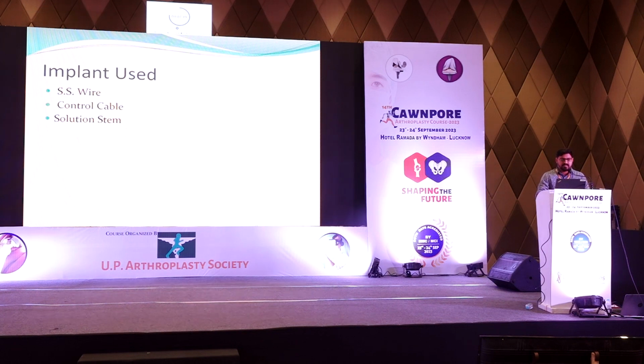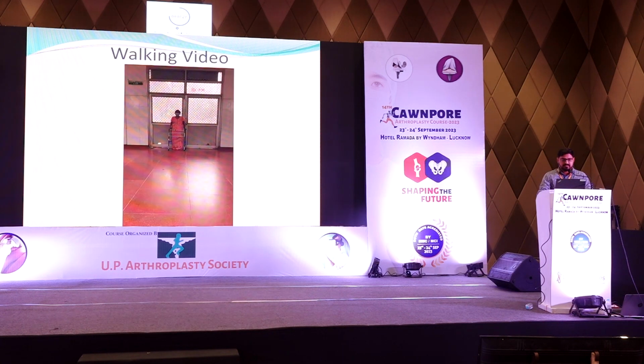The implants we use are SS wire for fracture reduction and fixation. Control cable is used and the Solution stem is used. And this is the walking video one month after the surgery.